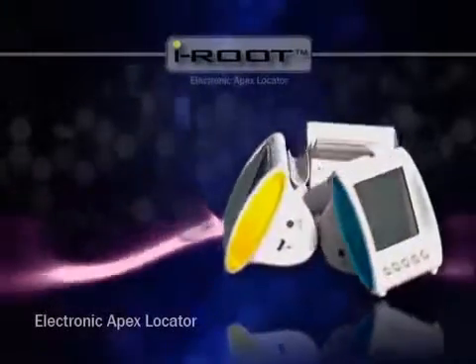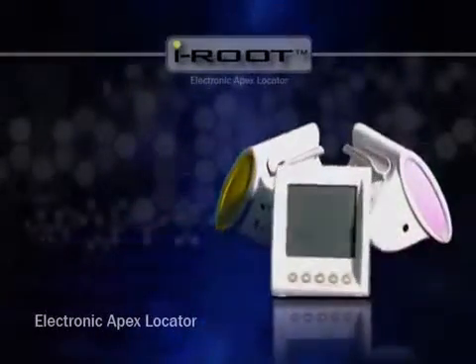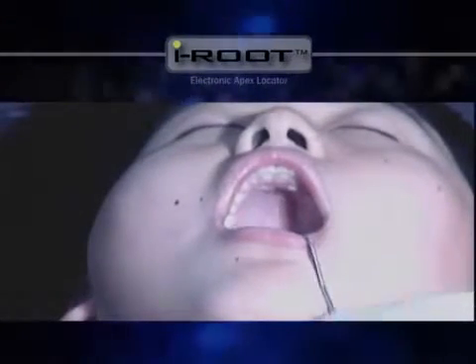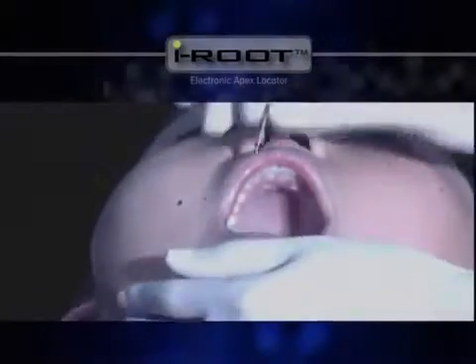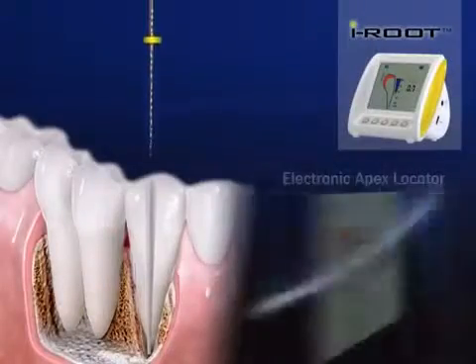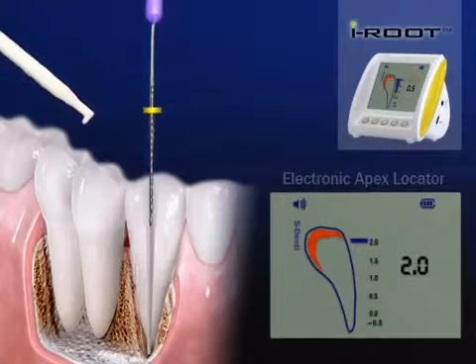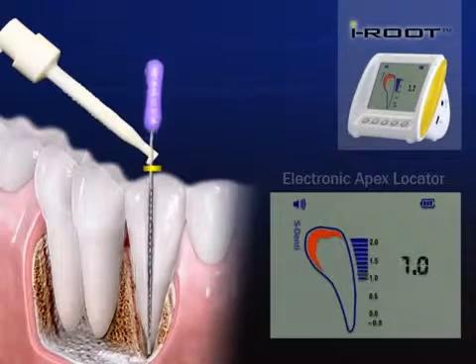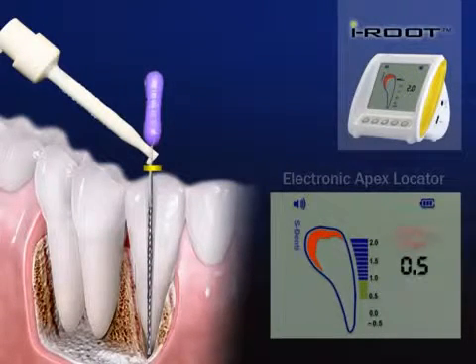Here's how to measure a root canal with iRoot. Turn the power on, hook the lip clip connected to the probe in the corner of the patient's mouth, and have the file ready. Clip the file holder to the file holder connected to the probe, insert the file, and slowly move it forward while rotating it gently until the meter on the screen shows .5.